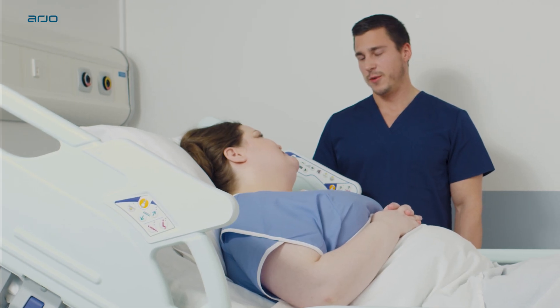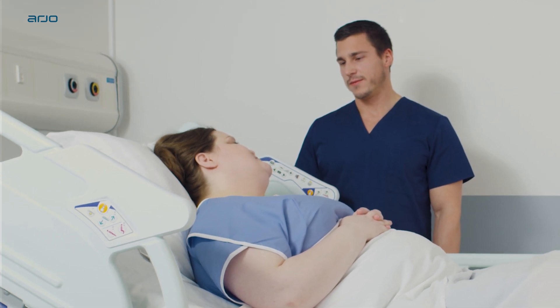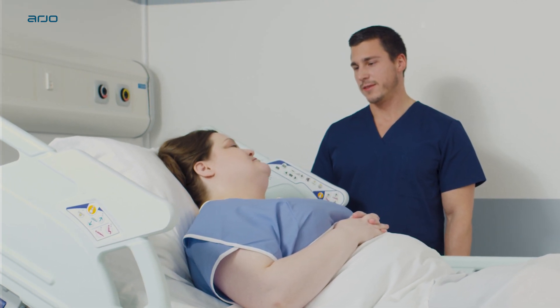The Atmos Air range offers a 24-hour care system when combined with an individualized monitoring, repositioning, and wound care program.